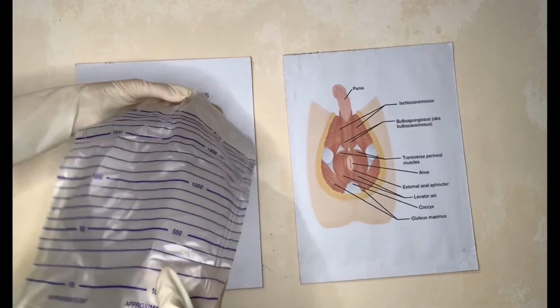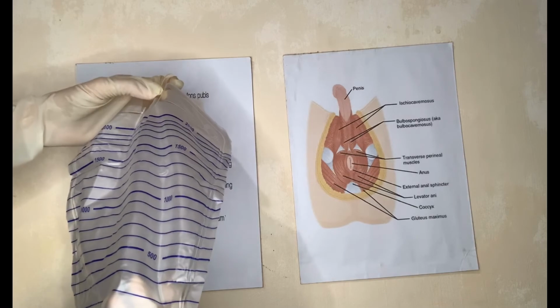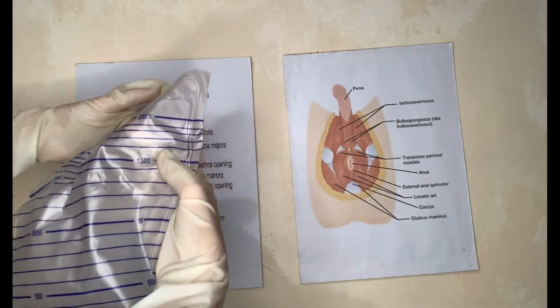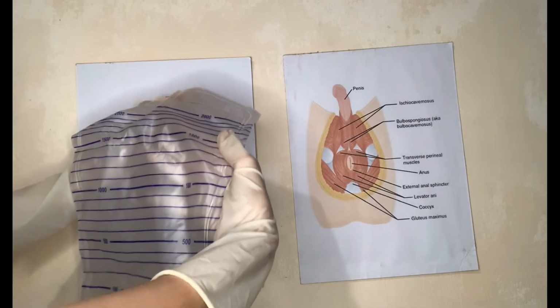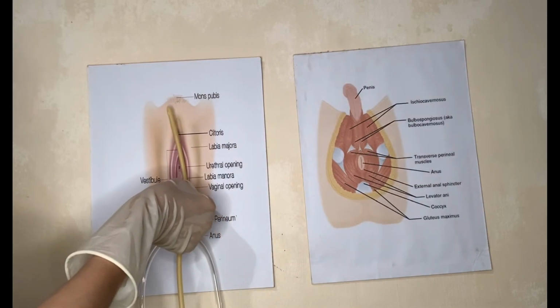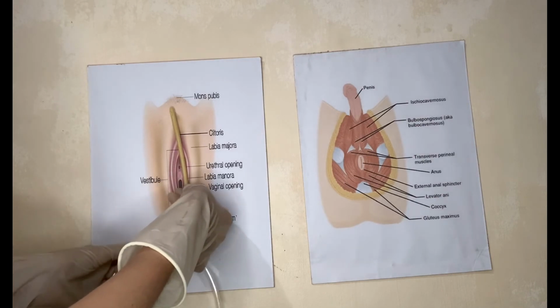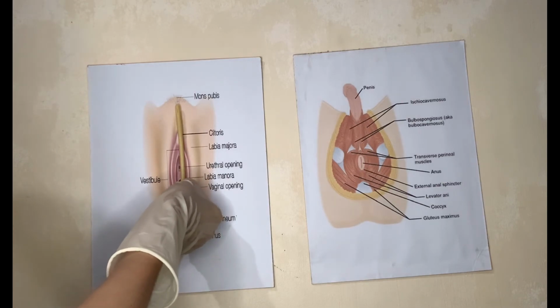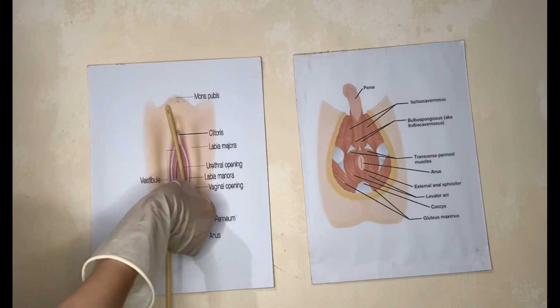So now we will examine and measure the urine. In some cases, only 750 to 1000 ml of urine are to be drained from the bladder at one time. Check agency policy for further instructions if this should occur. For an indwelling catheter, secure the catheter tubing to the thigh for female clients, or the upper thigh or lower abdomen for male clients, with enough slack to allow usual movement. This prevents unnecessary urethral trauma.